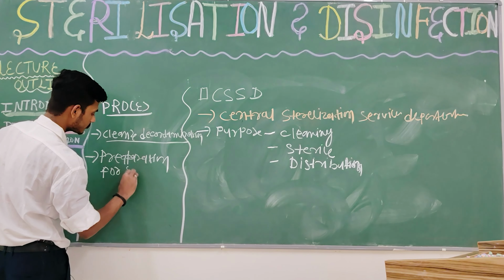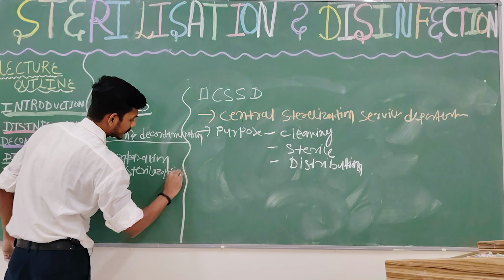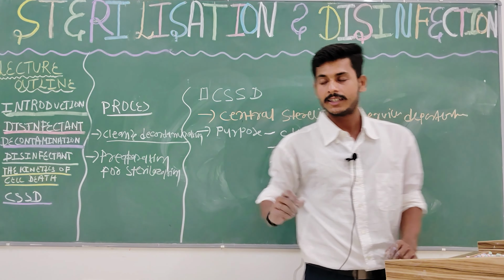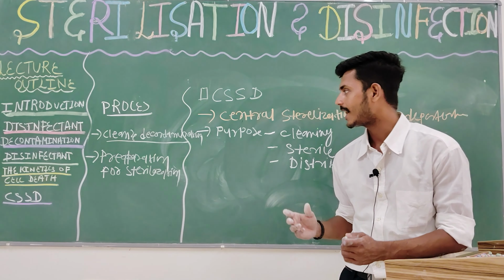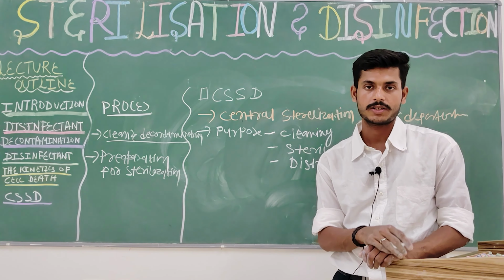After cleaning and decontaminating the equipment, we are preparing for sterilization, meaning we are deciding the method of sterilization.